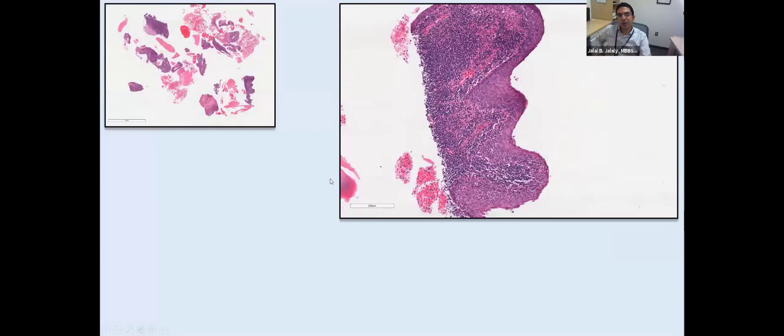Taking a closer look at these cellular fragments, you can see that there is squamous mucosa that looks similar from bottom to top. There's not much maturation going on, but it does not look obviously dysplastic or cancerous at this level, but definitely noting the fact that it's not maturing quite nicely, and it's lined by this lymphoid tissue.